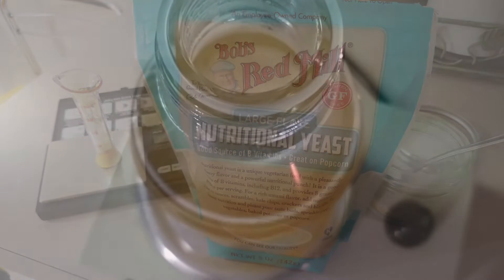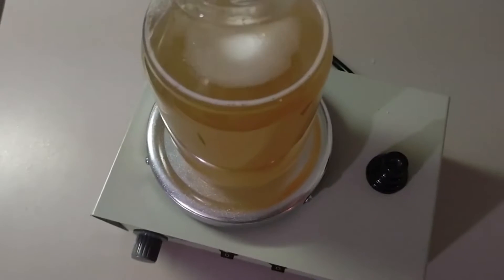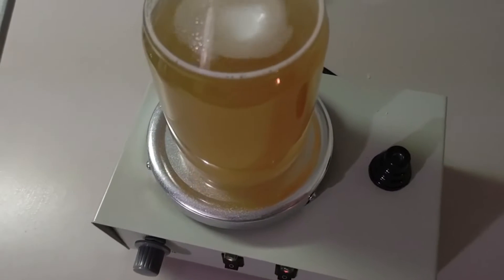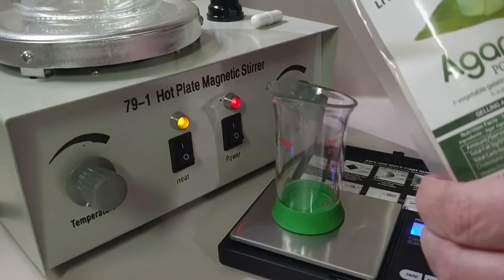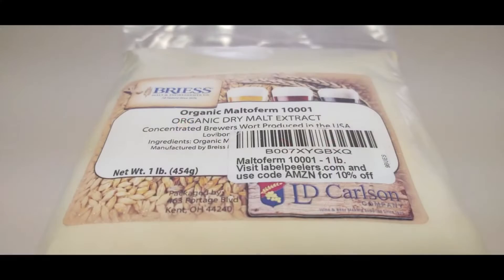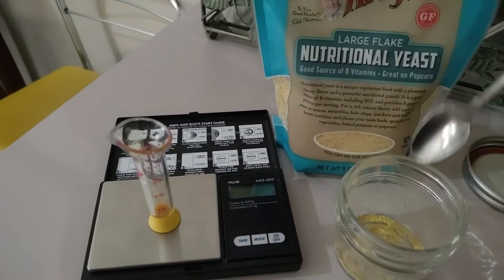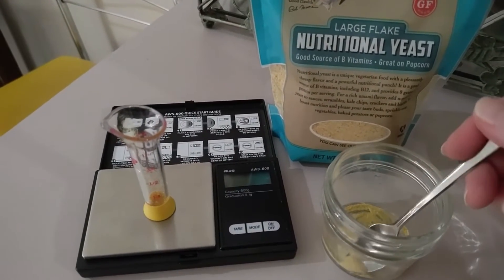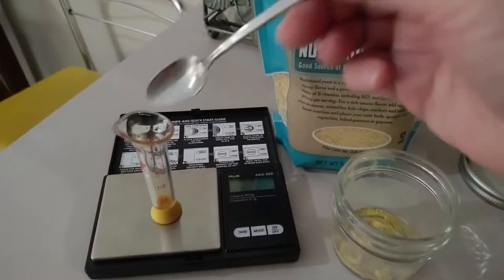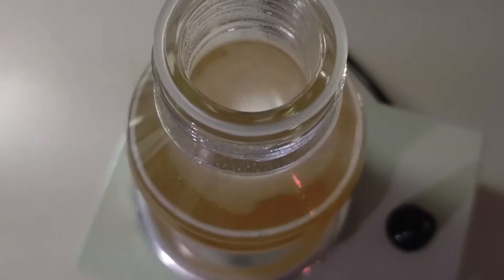We experimented with many different recipes, and we really feel like we've perfected this one. So when creating 500 milliliters, you want to use 10 grams of agar, 7.5 grams of malt extract, and 0.25 grams of nutritional yeast — again, to create 500 milliliters.